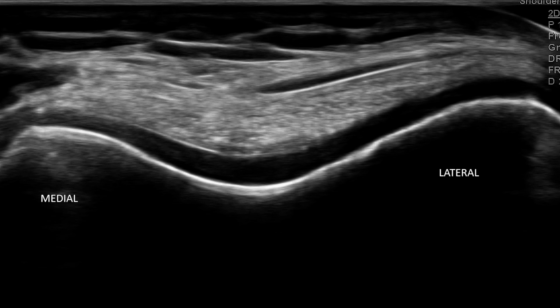This image shows normal articular cartilage in the transverse plane at the level of the intercondylar trochlear groove. The cartilage layer is smooth, homogeneous, and uniformly hypoechoic. The superficial contour is regular and the subchondral bone line is sharply defined.